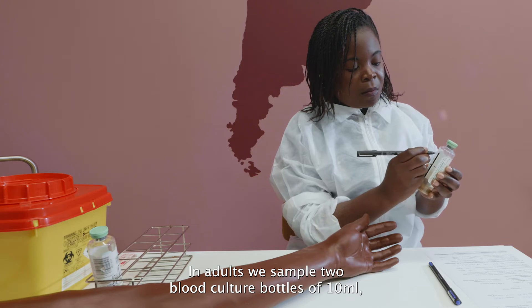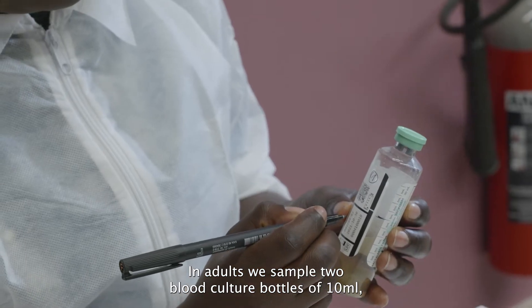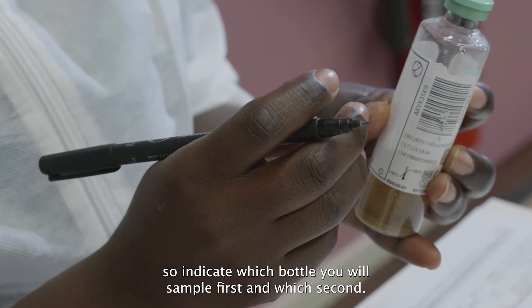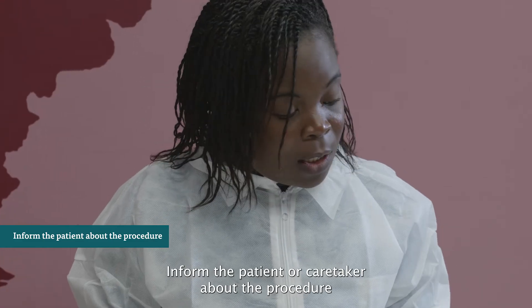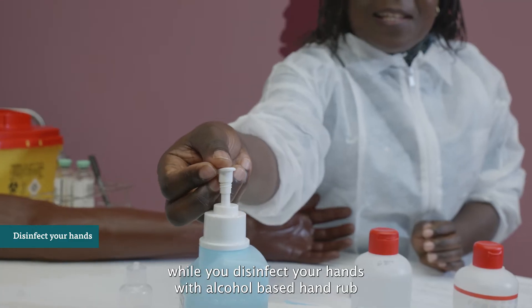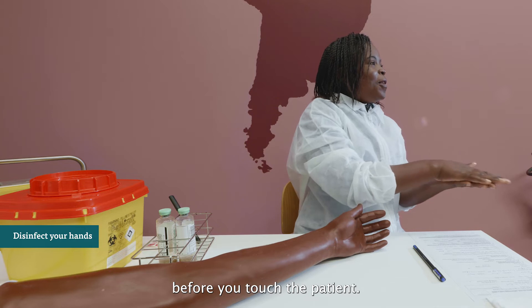In adults, we sample 2 blood culture bottles of 10 ml, so indicate which bottle you will sample first and which second. Inform the patient or their caretaker about the procedure while you disinfect your hands with alcohol-based hand rub before you touch the patient.